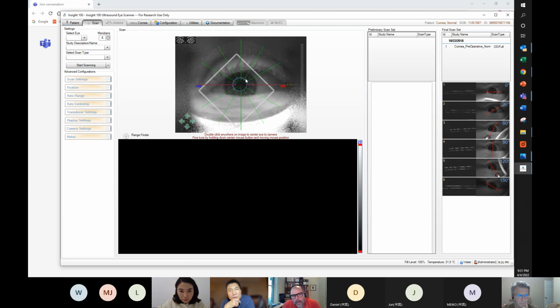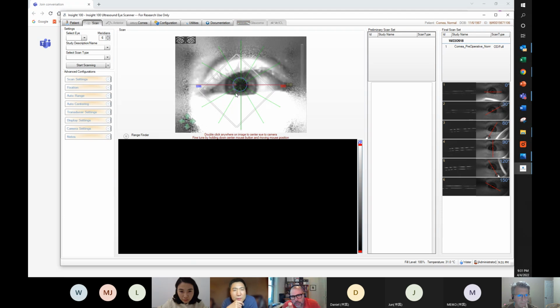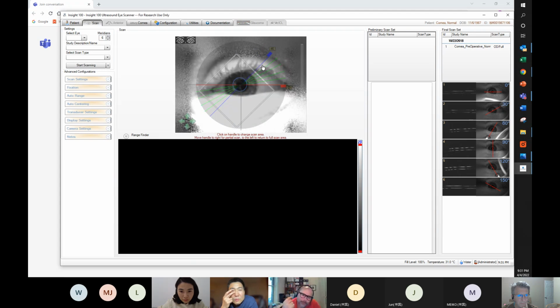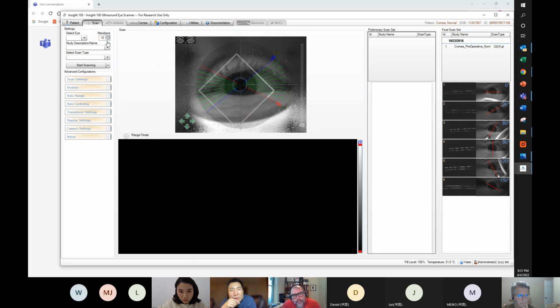I will shrink the lines. I will put them all together between hours 3 and 9, and I will be able to provide measurements. If I do that, I can. Okay, got it. So you can adapt the measurement based on the area that you want to scan.